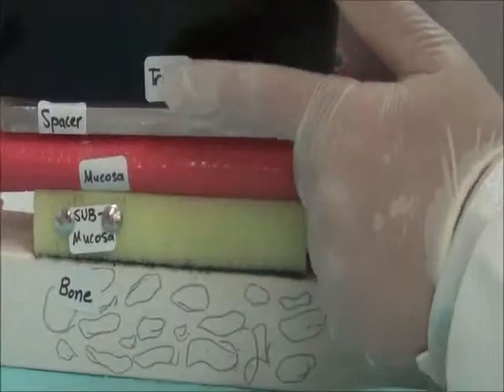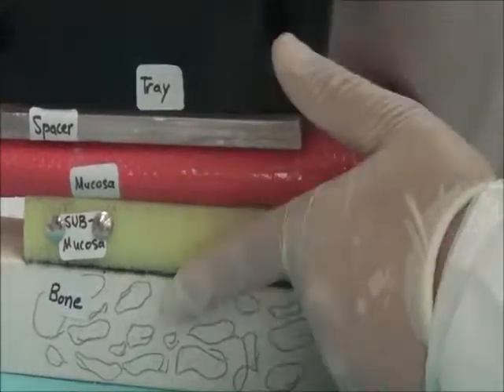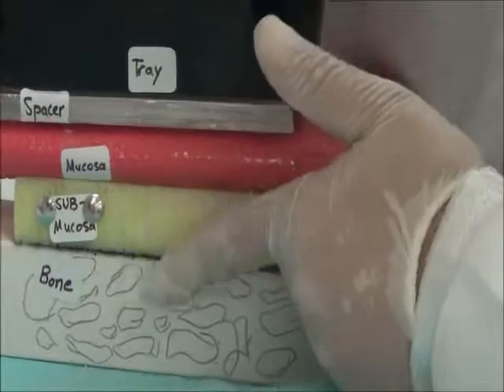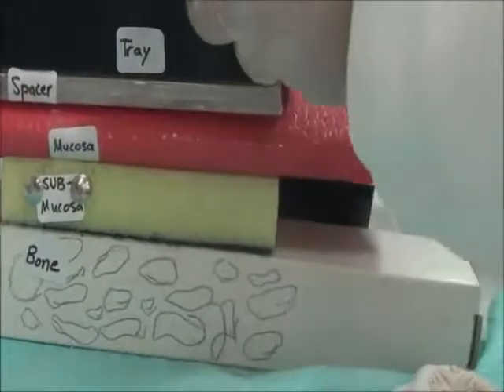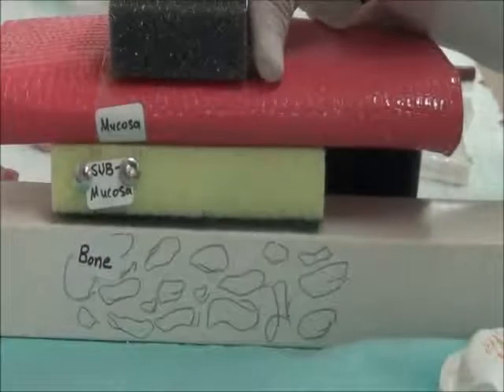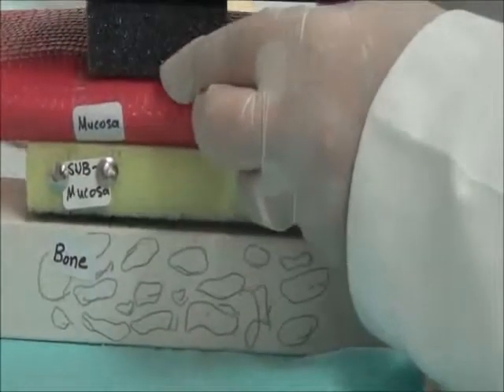So this is a tray with a wax spacer in, and the mucosa, submucosa, and bone. We take our border molding, see that the tissue is not compressed, and once we're ready to put in our impression, we remove the spacer and the tray, put impression material in here, in the tray, and come and begin squeezing.